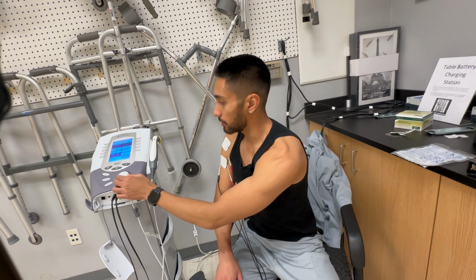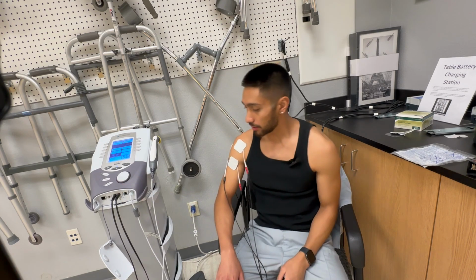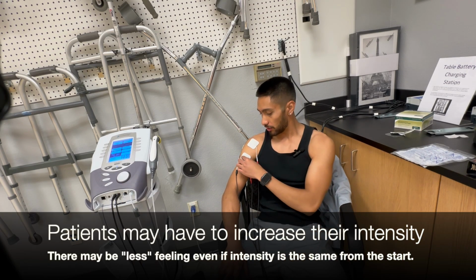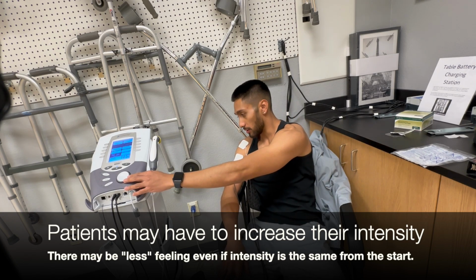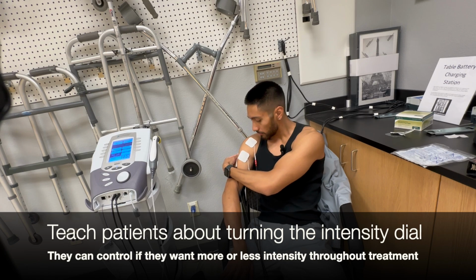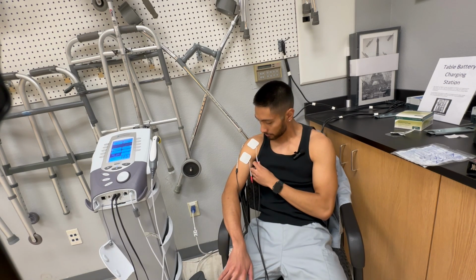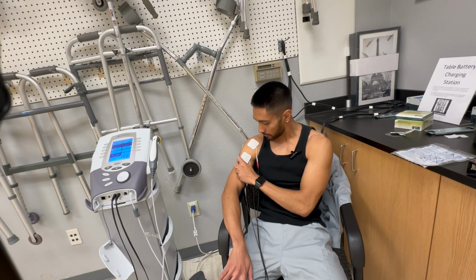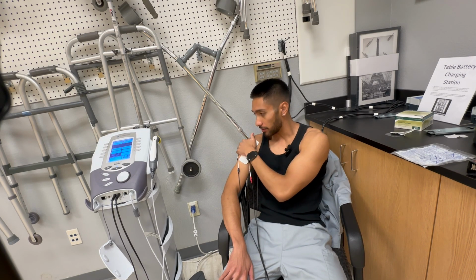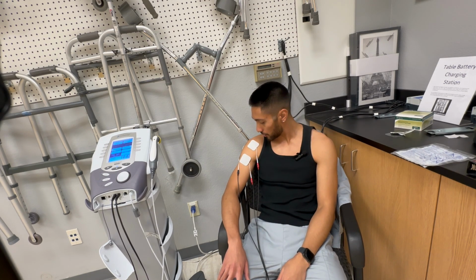Once again, intensity needs to be slightly increased throughout the treatment time, depending on the patient and what they are feeling. There is a feeling of twitching, and now I'm feeling that tingling sensation.